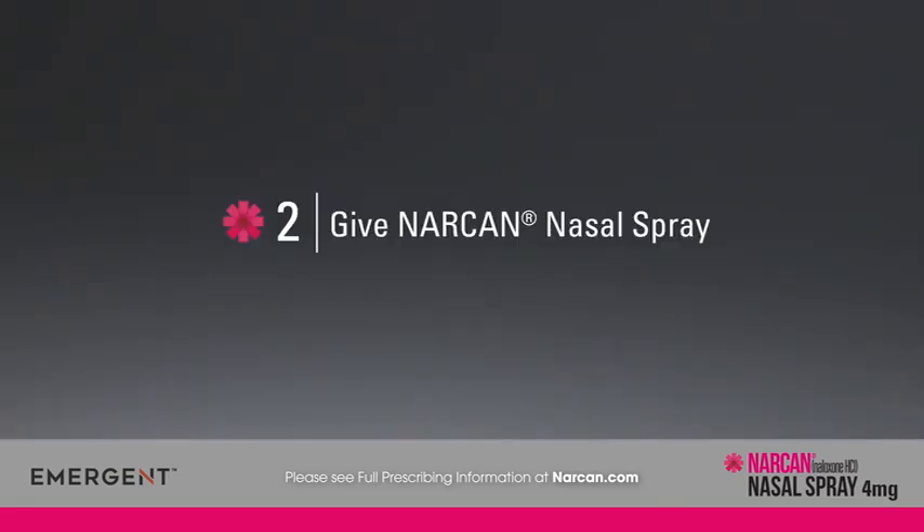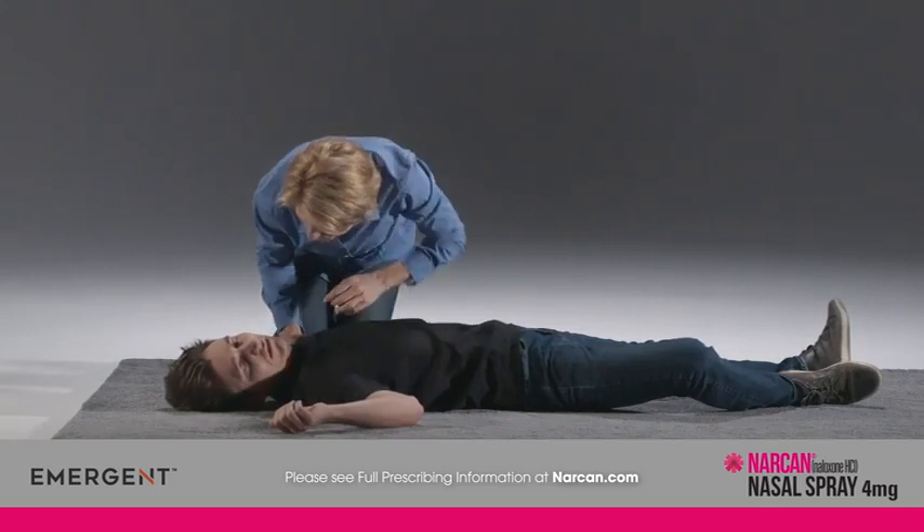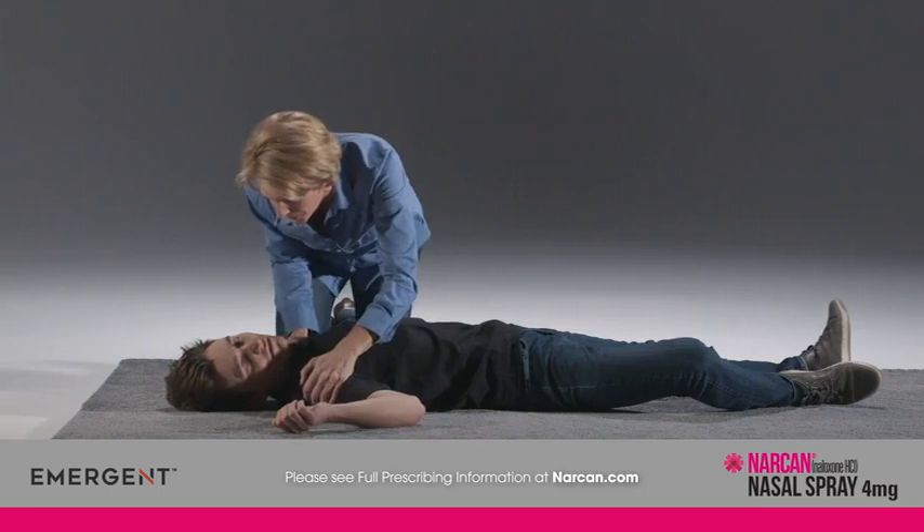Administer Narcan nasal spray as quickly as possible if someone is unresponsive and an opioid overdose is suspected, even when in doubt, because prolonged respiratory depression may result in damage to the central nervous system or even death.